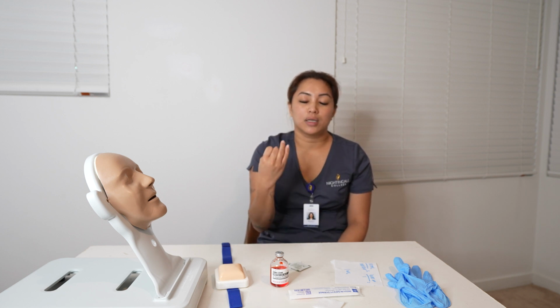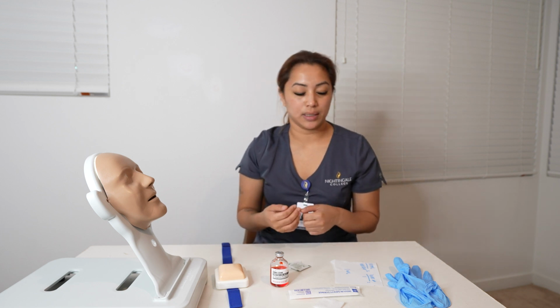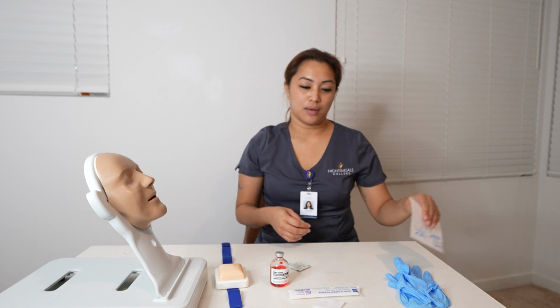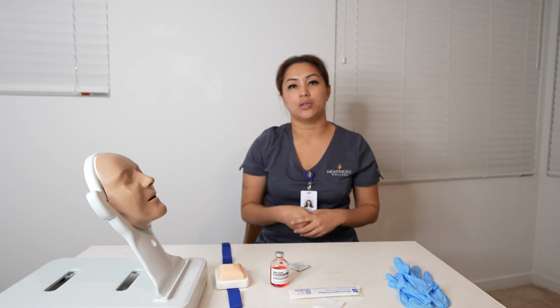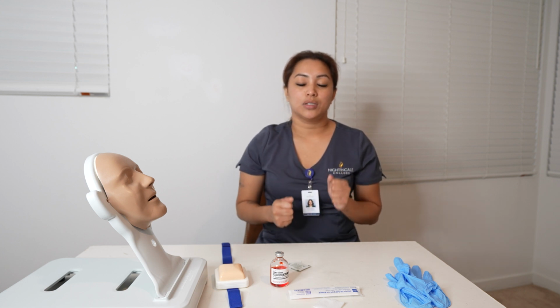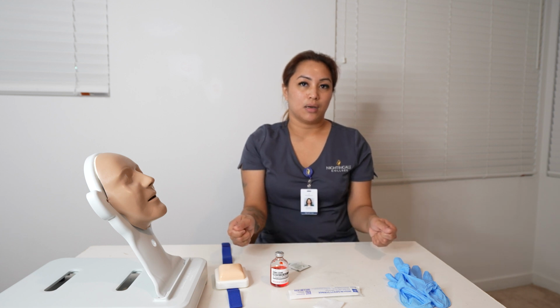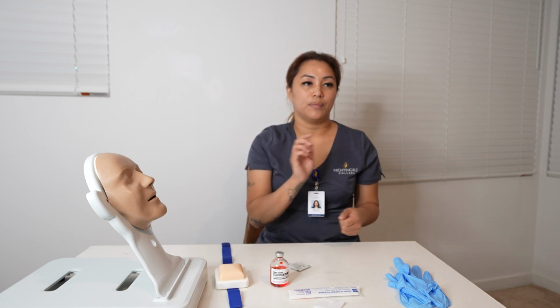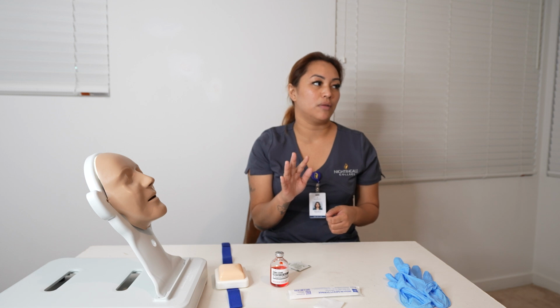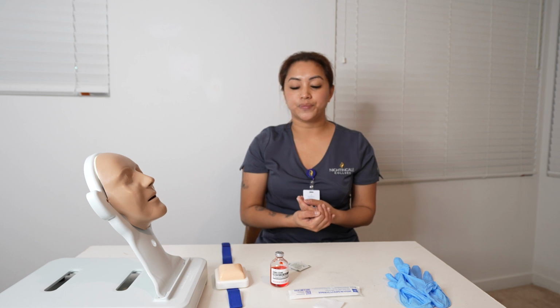syringe. Alrighty. Before I start, I'm going to verify the 6 rights: right patient, right drug, right dose, right time, right route, right documentation. Now that I have done the dosage calculation on the side, I am going to gather my supplies, walk to the patient's room, knock on the door, provide the privacy curtain, place all my supplies on a clean flat surface, check the room if there are any family members. There are no family members. We don't want to violate any HIPAA.